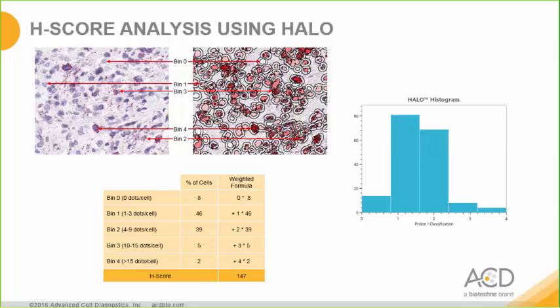Halo can bin each and every cell in a region of interest based on the number of dots in that cell into a previously defined category. A single H-score can be calculated. This histogram is similar to the one that we saw earlier with SPOTSTUDIO. However, the y-axis here is number rather than percentage of cells. Over here is the percentage of cells in this field of view in each category and the H-score calculation.